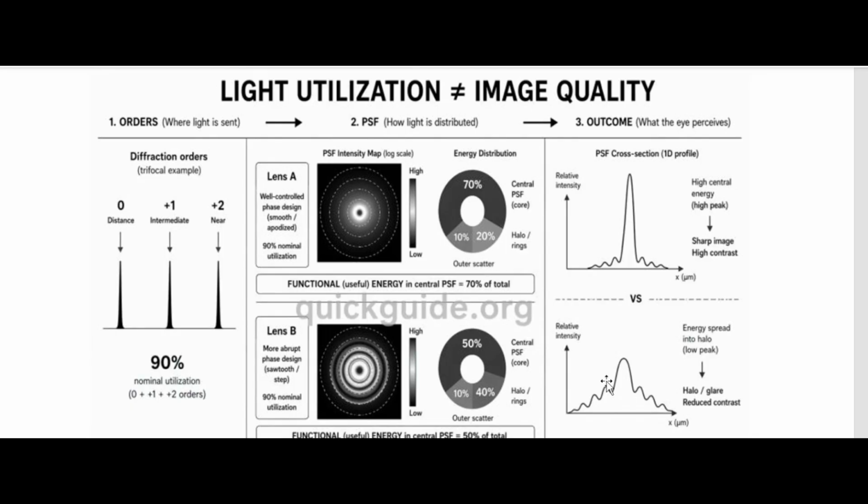not have significantly better image quality, because when we talk of high light utilization, companies generally measure that light utilization through the total PSF, that is, the Airy disc plus the Airy pattern. But the MTF, or modulation transfer function, of an IOL is taken from the central lobe of the point spread function, that is the Airy disc, and they convert it through Fourier transformation into MTF values.